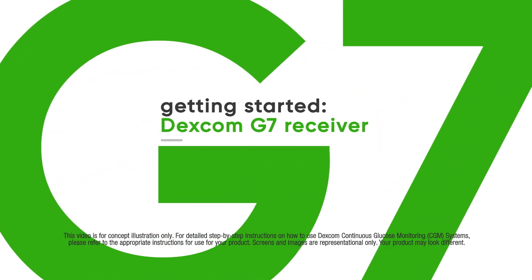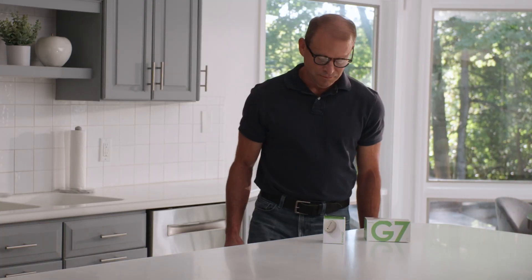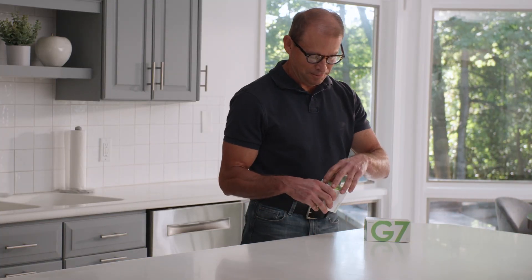Getting started with the Dexcom G7 receiver is easy. Paul has just received his system. Let's watch him get it set up.